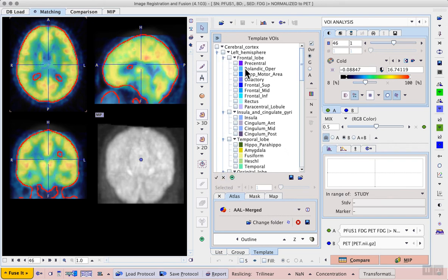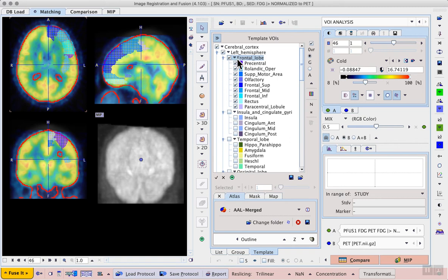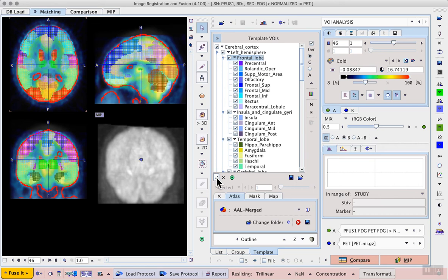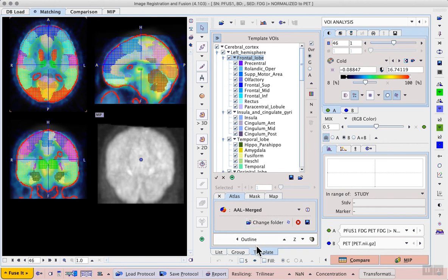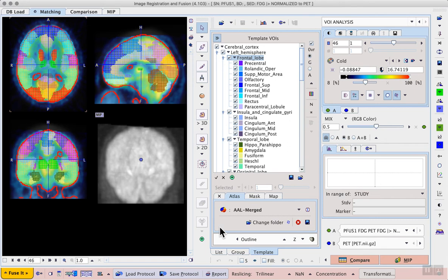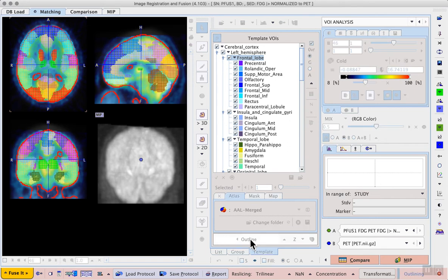For example only left frontal lobe to be transferred to the data in a moment. For this example I will select everything and then to use the VOIs for analysis I should outline them, the button below the atlas selection so that they're actually converted from this pre-definition actually saved as maps in our resources into VOIs based on contours that we can use.